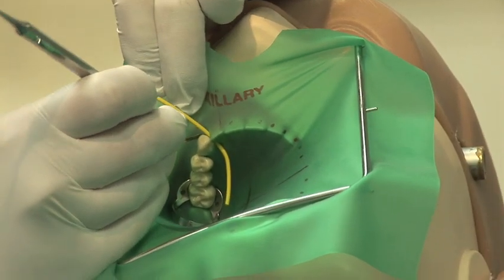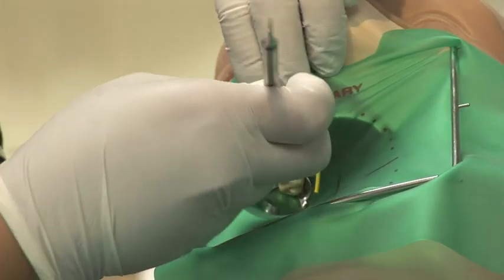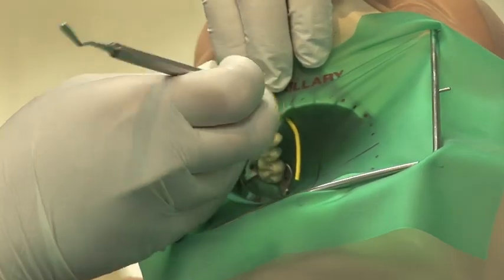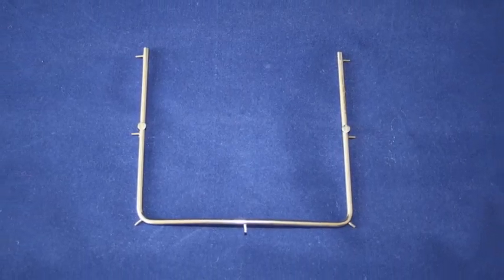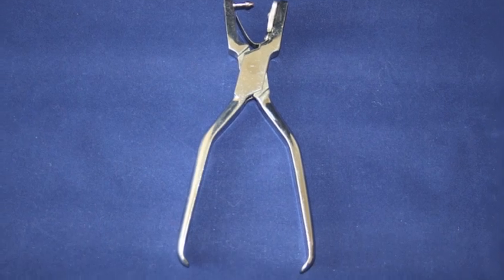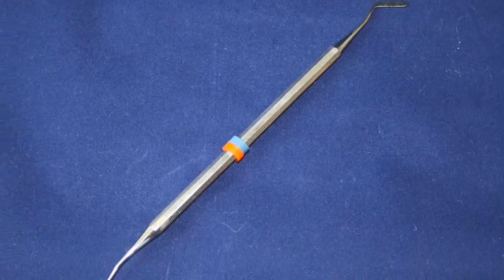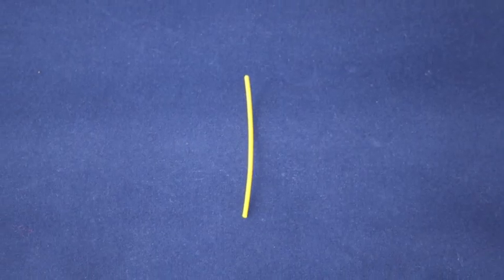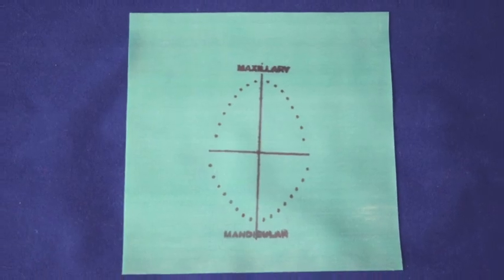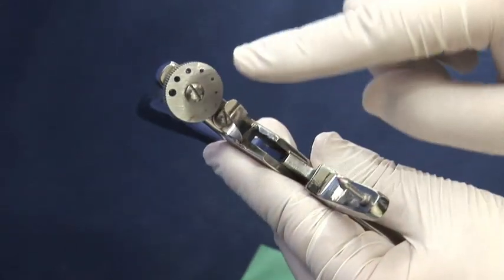This video will demonstrate how to prepare and apply a rubber dam. To prepare the rubber dam, you will need the following items: a rubber dam frame, a rubber dam clamp, the rubber dam punch, the clamp forceps, a flat plastic instrument, wedgets, dental floss, and ideally a stamped rubber dam sheet.